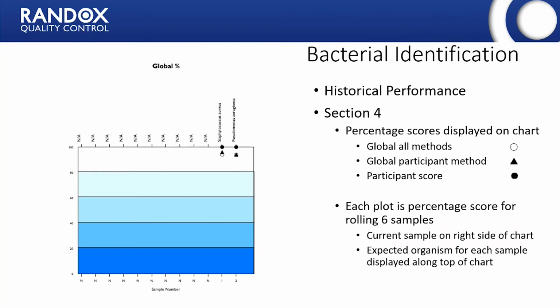Now, just one thing to mention on this chart is whenever you're looking at each individual sample, this will change over time. We're looking at changes of performance overall.